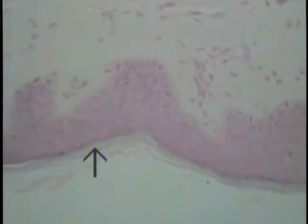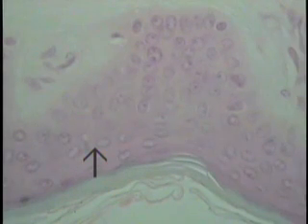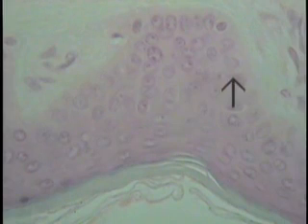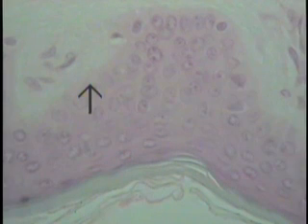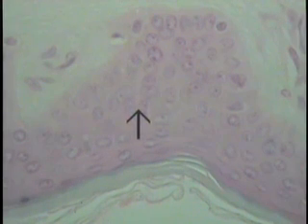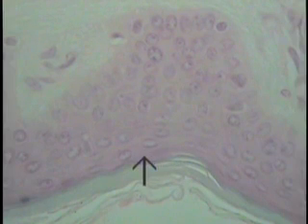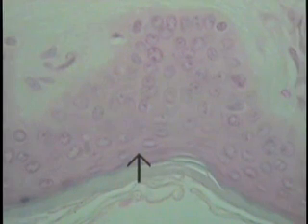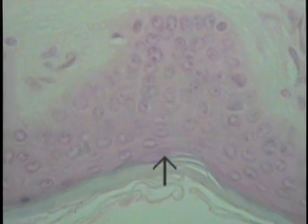Examine a section of skin at increased magnification. A typical section at increased magnification through thin skin. Once again, a very thick type of epithelium consists of several layers of cells, therefore satisfying the definition of being stratified. These cells change their shape, which one needs not worry about at the present time, and become a very flattened squame-like cell. You can see here by the nuclear profile and a little bit of cytoplasm that is extending out, and then will become the keratin.